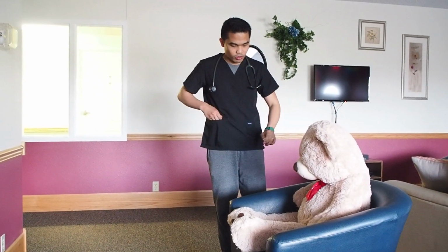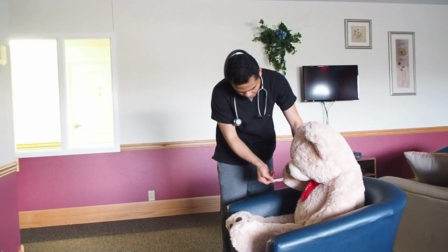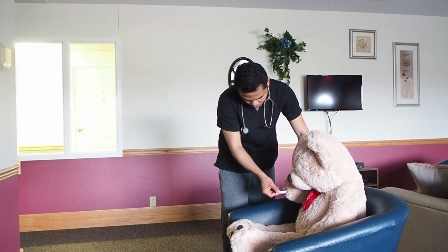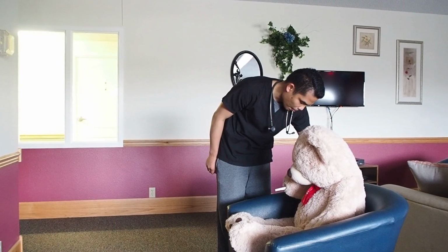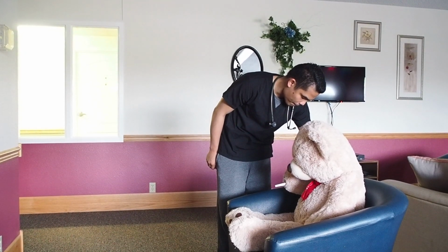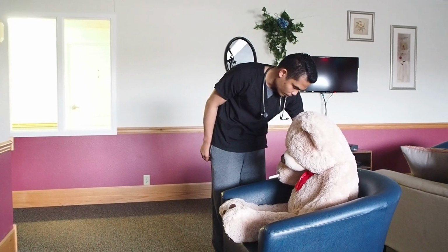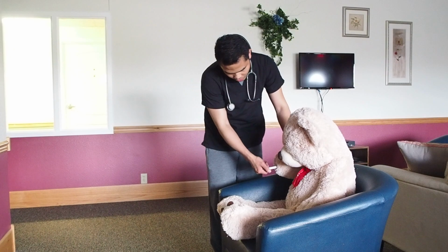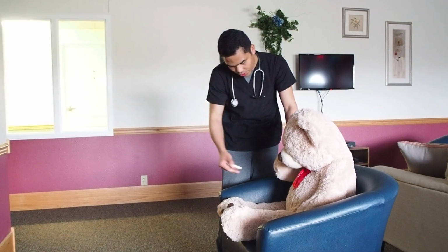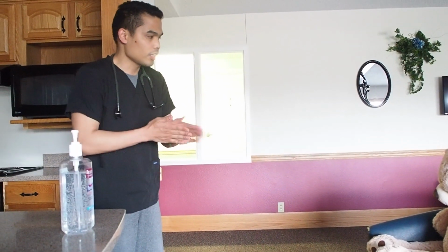So I'm going to check your heart rate, and then I have here a portable pulse oximetry. Check your level of saturation. So I think we're done taking your heart rate and also your level of saturation. I'm going to sanitize my hands again.